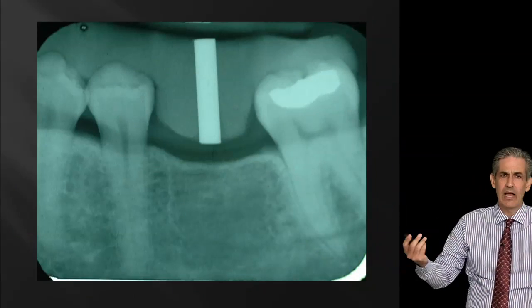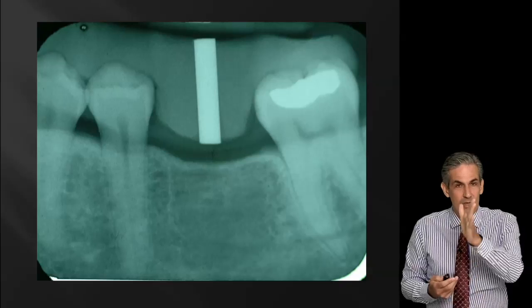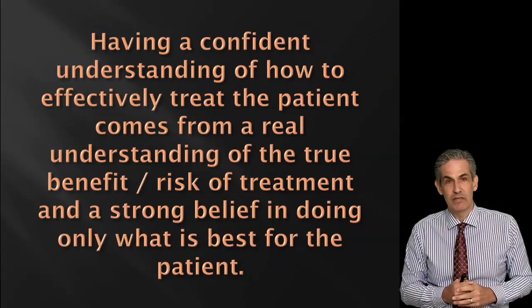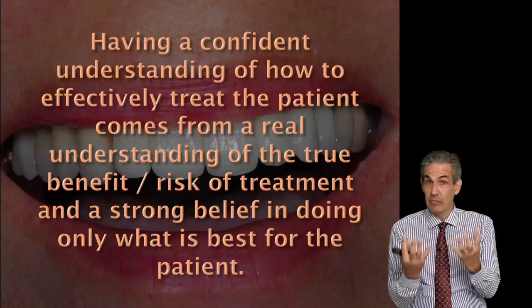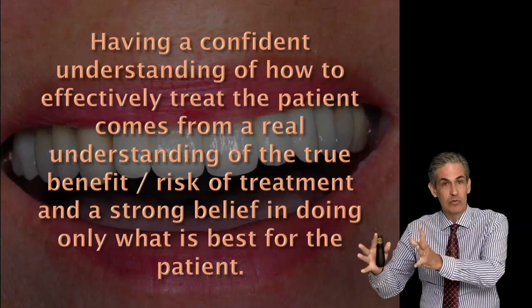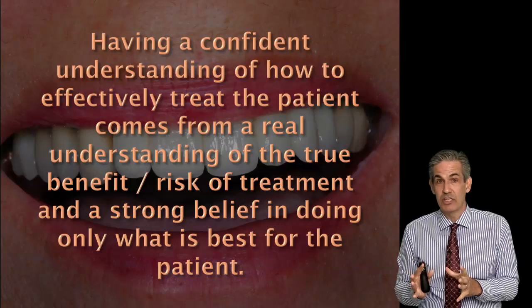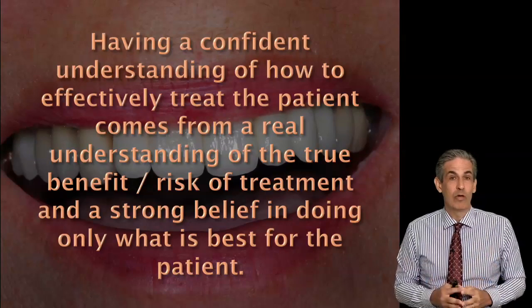A surgical guide can be simple, just a small piece of acrylic with a particular guide to place that implant exactly where we want it to be, to give the patient what they're hoping to achieve. So when we can really understand the patient, and we develop that during treatment planning, when we get the patient on board and part of the team, and then we can translate that into a surgical guide to exactly explain to the surgeon what we're trying to achieve, I think we get the results, the predictability, the outcome that we're hoping to have.